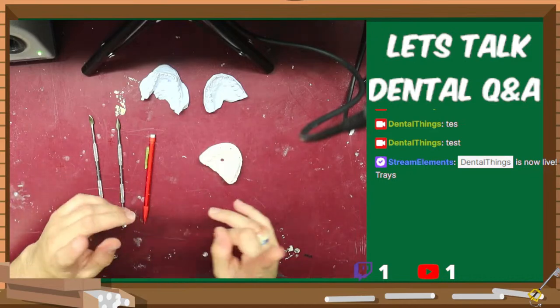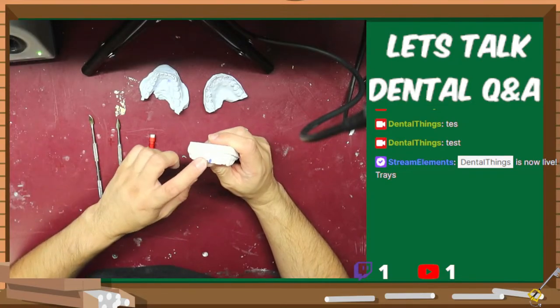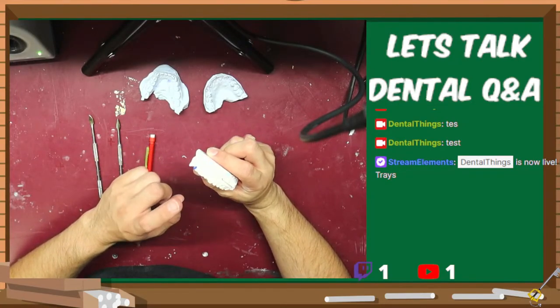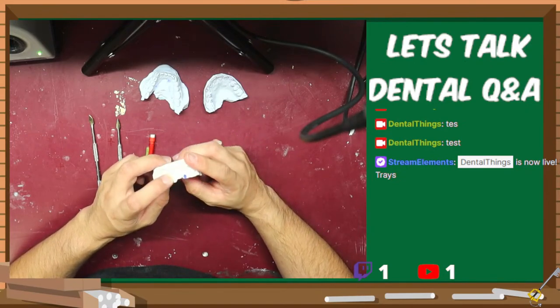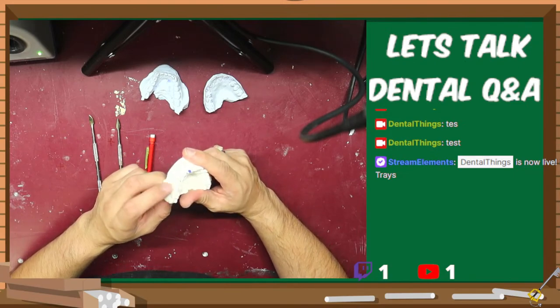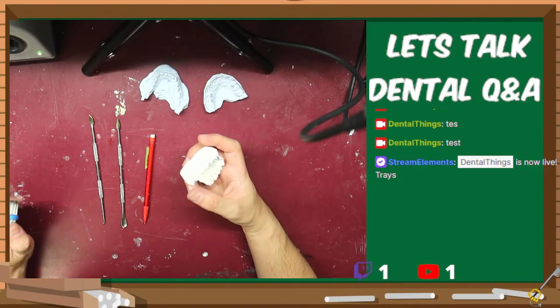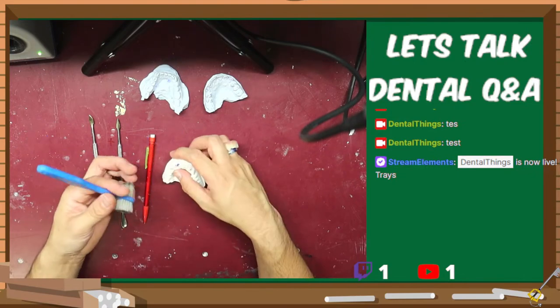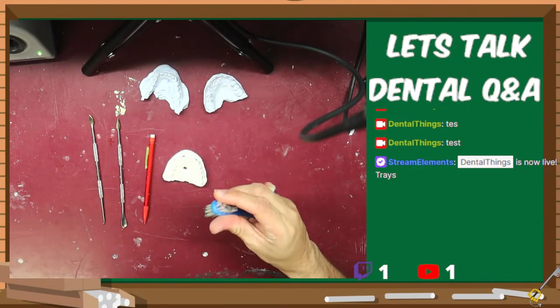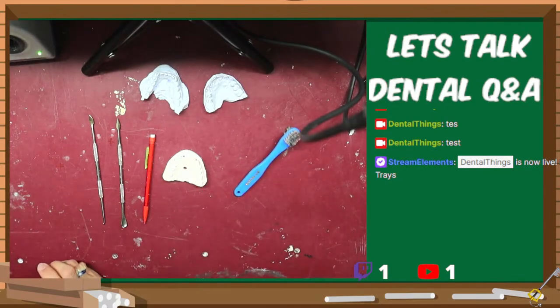All right. So, with these teeth, they don't seem to be that badly in shape. But, because this is a pretty old model that I made for this patient, I need to go and repair a couple places on it before I go and super jump into trying to fix everything. Another thing I want to do is I want to go and fix my denture brush that I have here, because my other little lab techs put a bunch of wax on here, so I need to fix that one a little bit too.